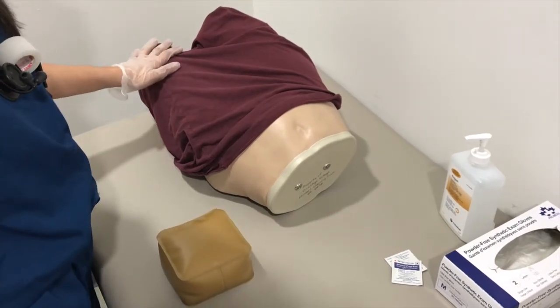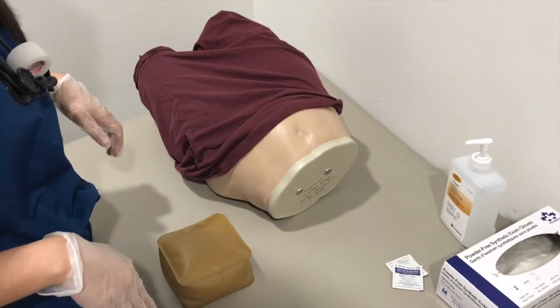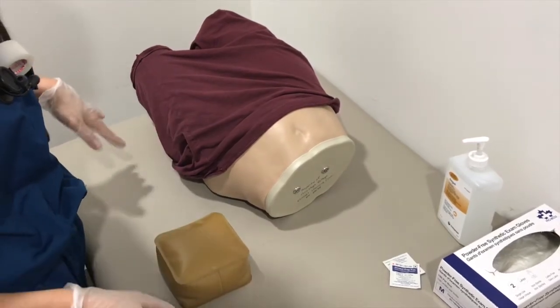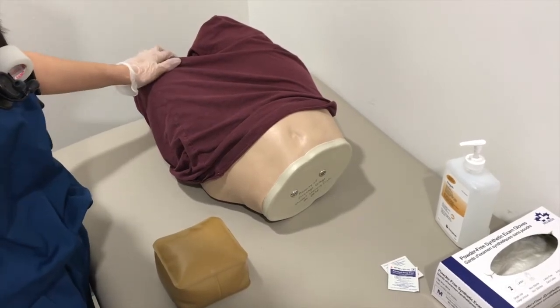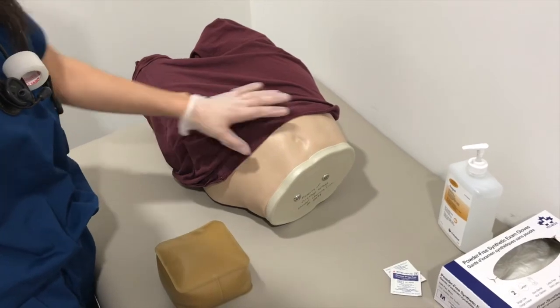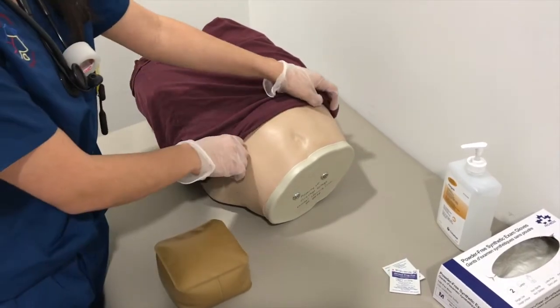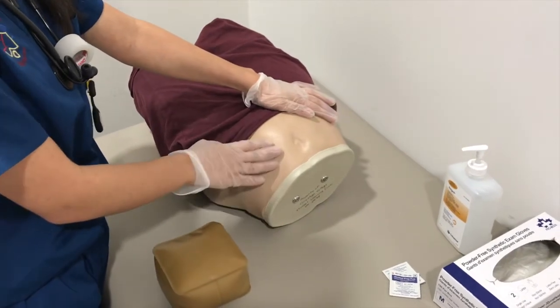of sodium chloride injection. And I'm going to be doing intramuscular and a subcutaneous injection today. So the first, I'm going to start with their subcutaneous injection. Do you have any questions before we get started? No. Okay, perfect. So I'm first going to be doing the subcutaneous injection in the stomach area, abdomen area of the patient.